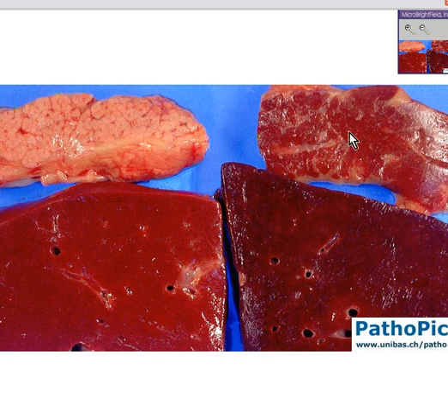I believe these are, no, let me take that back. These are lymph nodes above it. Here's a normal lymph node. Here's a lymph node that's browner than it should be. Here's a normal liver, and here's a liver that's browner than it should be.